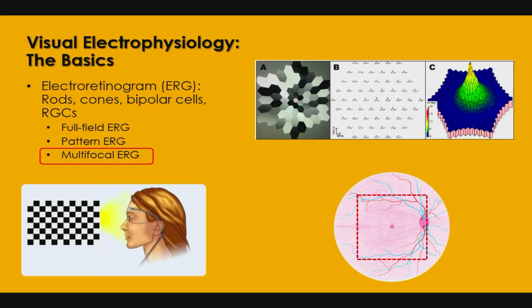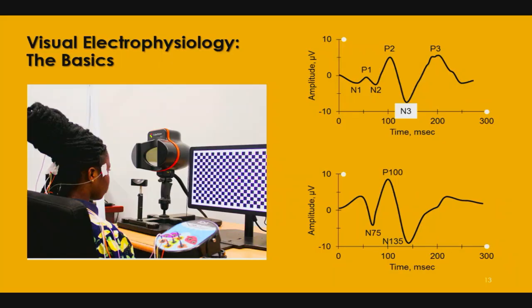Basically, each spot behaves like a small flash that comes on and goes off. Now, again, they've done some wild mathematics on this thing. At each point, the computer knows which parts of the screen turned on, and there's a topographical map. Of course, the average topographical map is somewhere in the system. So if, go back. Now I'm going forward. Wait. All right.